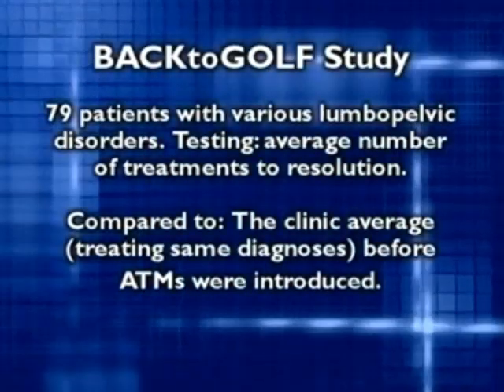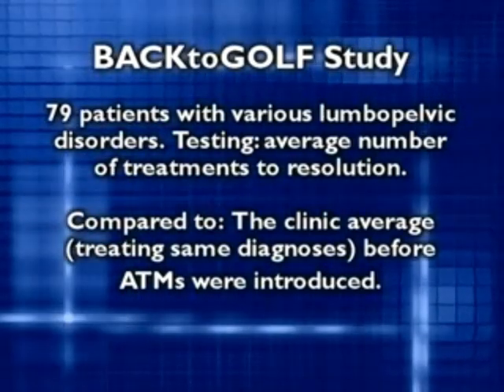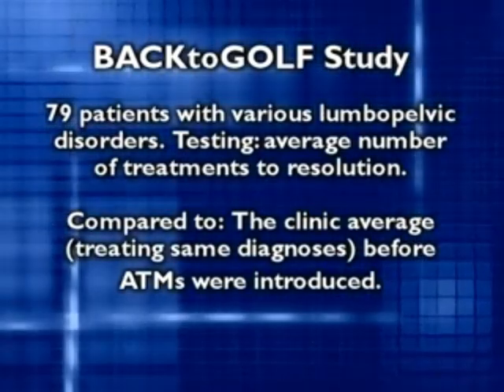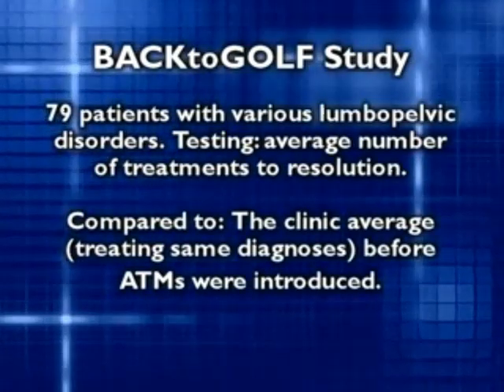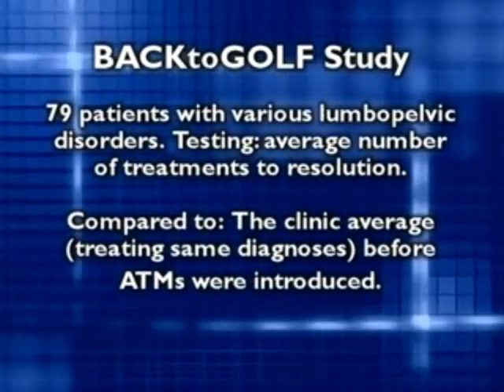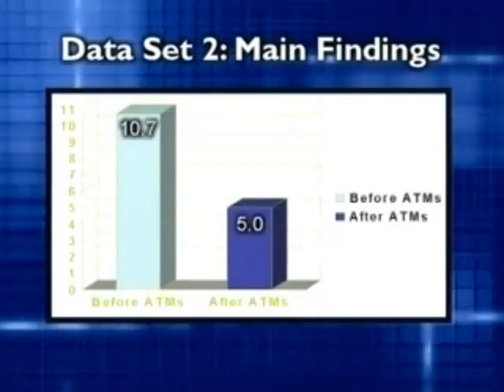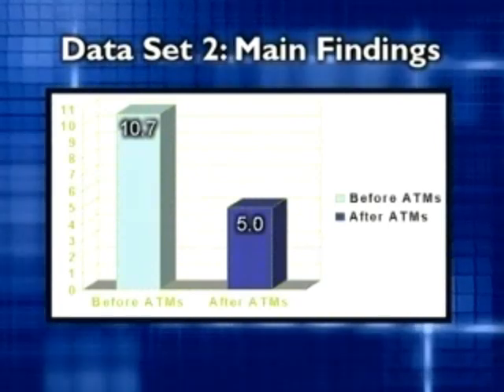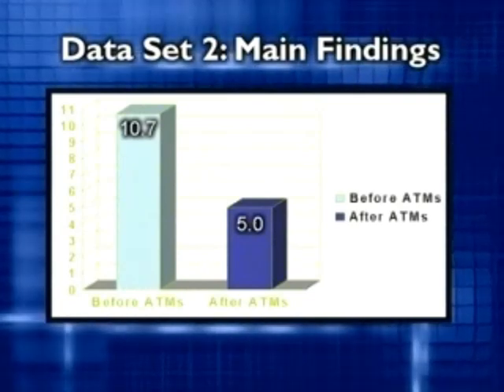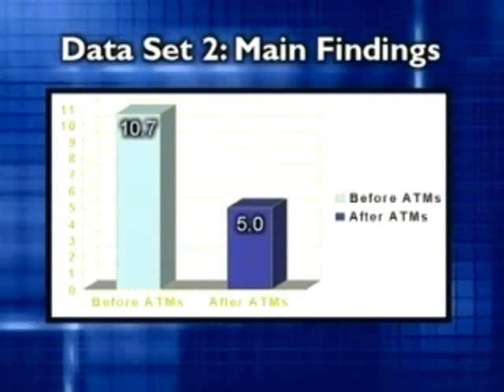Other significant results showing the ability of this concept to assist in resolving lumbar conditions significantly faster have been reported by Dr. Mark Archambault at the Back to Golf Clinic in Windsor, California. The clinical data demonstrated that incorporating the ATM concept into their performance and fitness physical therapy significantly shortened the amount of treatments needed to resolve an array of lumbar diagnoses. A total of 79 patients receiving ATM treatments as part of their management were compared to patients with similar lumbar diagnoses treated at the clinic before the introduction of this concept. The average number of treatments was more than halved, from 10.7 to 5.